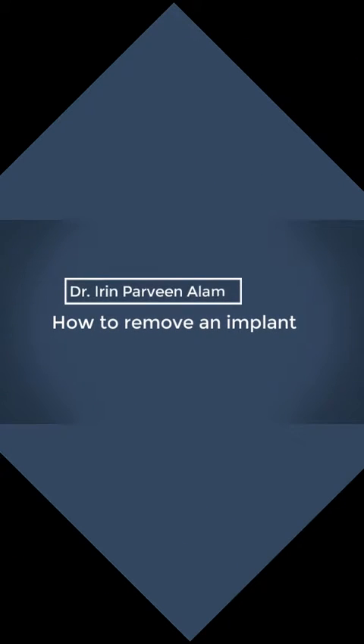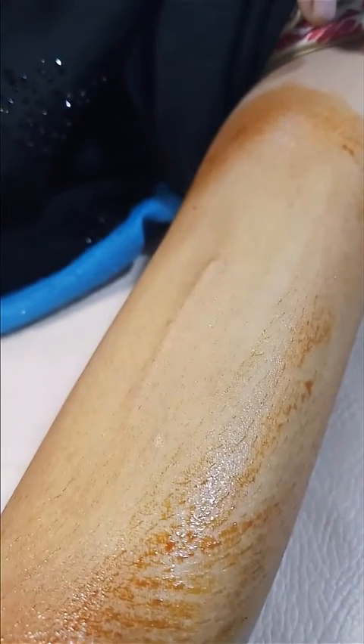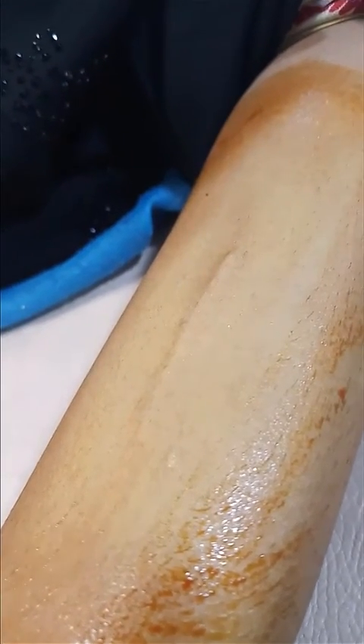In this video we will show how to remove an implant. An implant is a long-acting contraceptive device which is inserted on the inner aspect of the non-dominant hand. Its action remains for three years.